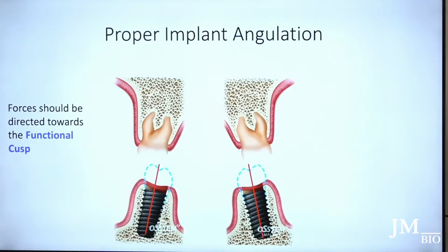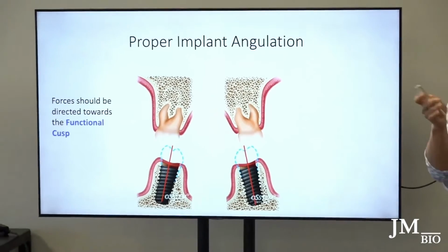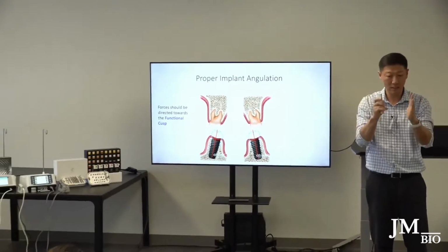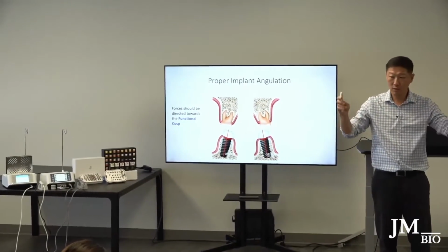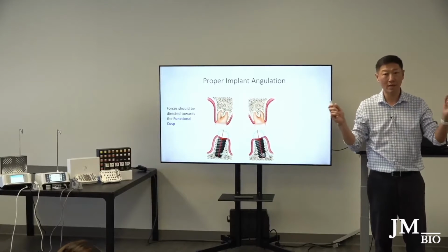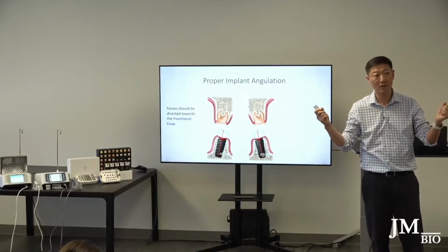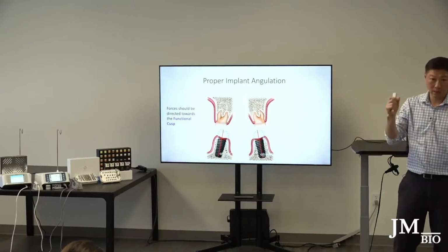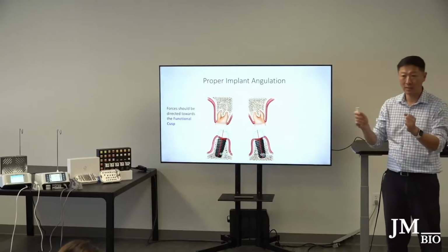All-on-X is a little bit different. You might ask, how come with all-on-fours you have implants angled like this and then implants here? But the balance of force between this one and this one, with the multi-angled abutment, offsets this pressure here. That's the reason it actually likes it, because it's not a single standing implant holding that direction. But a single implant actually likes the forces up and down, not sideways, okay?